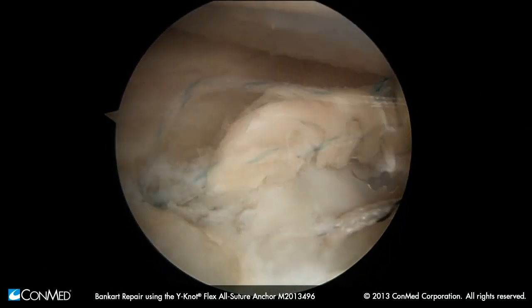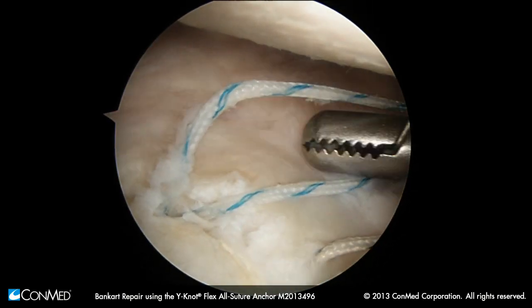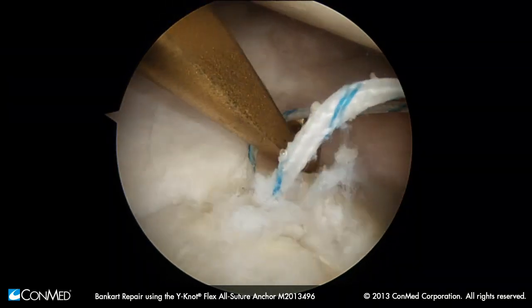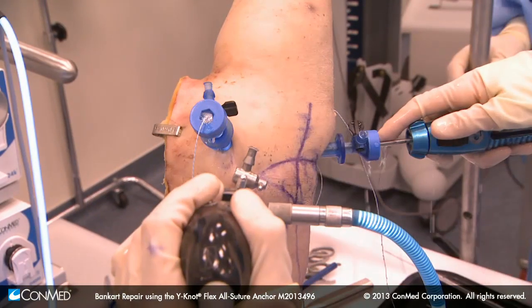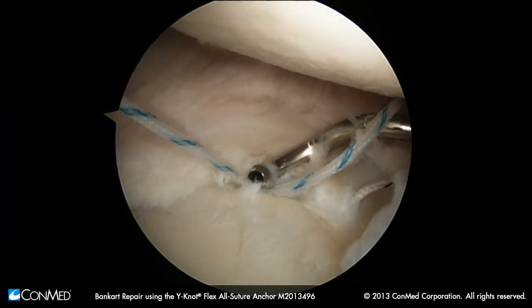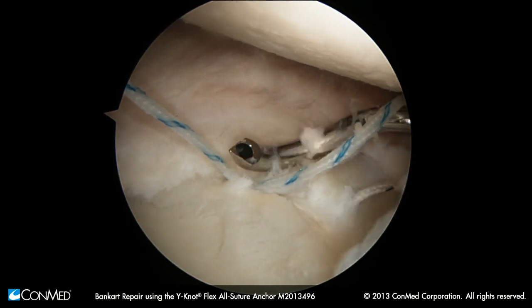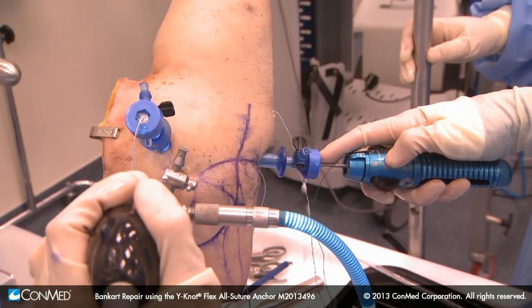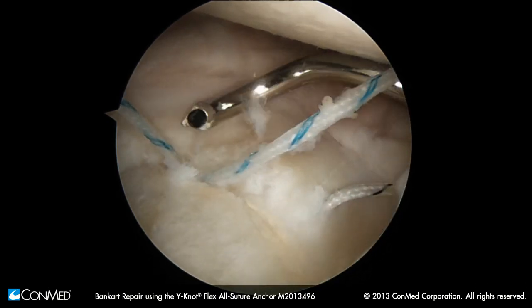I'm going to tie this one down because I'm done with that one, and then we're going to pass this one through the tissue in the back. In order to do that, we're going to shuttle — we're going to suture from the back. We'll take our inferior labral side stitch out the top, get our needle on the side of the limb that we want it to come out on, and set the tip of the needle at the point where we want it to come out from under the labrum. We call this a rehearsal. You'll see that my index finger is at the junction between the spectrum and the dry dock, so this tip is basically an extension of my index finger.